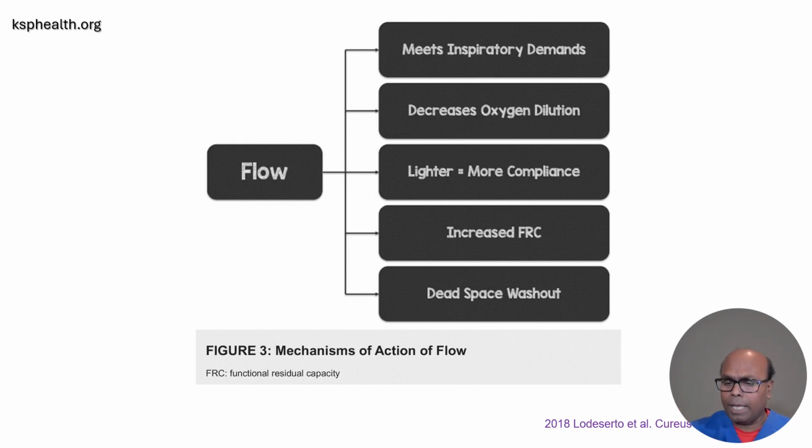When you inspire again, not only do you inspire the atmospheric air, you also inspire the expired carbon dioxide. 1/3 of the subsequent inspiration is from the previous expired gas that has carbon dioxide. When you use a high flow, it causes dead space washout so that the patient doesn't need to re-inhale his own carbon dioxide.